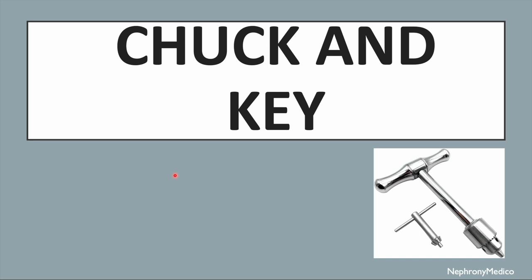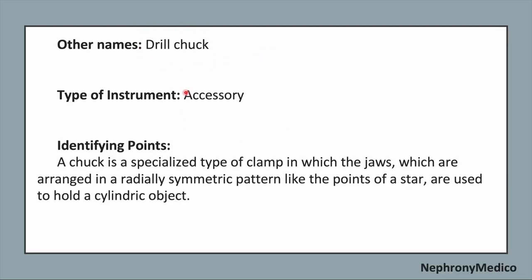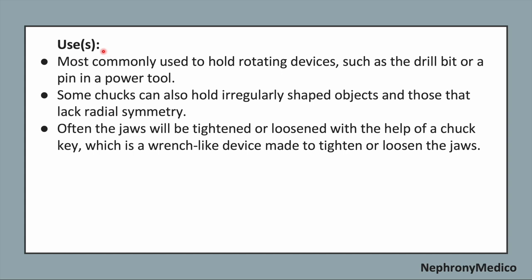Let's talk about chuck and key. This is a picture showing chuck and key. The other name is drill chuck and it is an accessory type of instrument. Now, identifying points: a chuck is a specialized type of clamp in which the jaws, which are arranged in a radially symmetric pattern like the points of a star, are used to hold a cylindric object. Use: it is most commonly used to hold rotating devices such as a drill bit or a pin in a power tool. Some chucks can also hold irregularly shaped objects and those that lack radial symmetry. Often the jaws will be tightened or loosened with the help of a chuck key, which is a wrench-like device made to tighten or loosen the jaws.